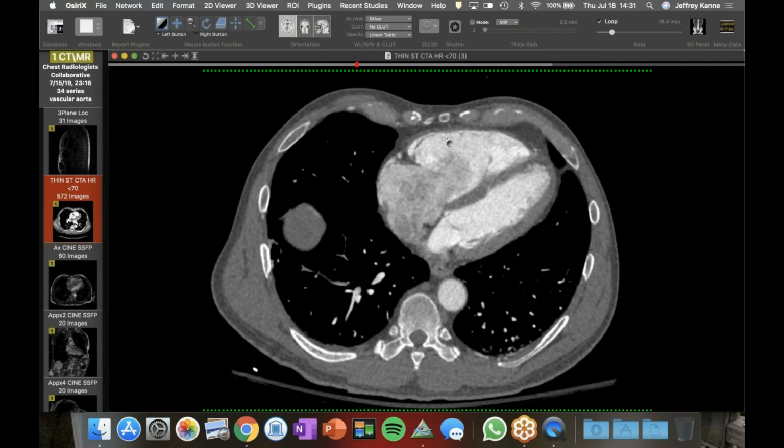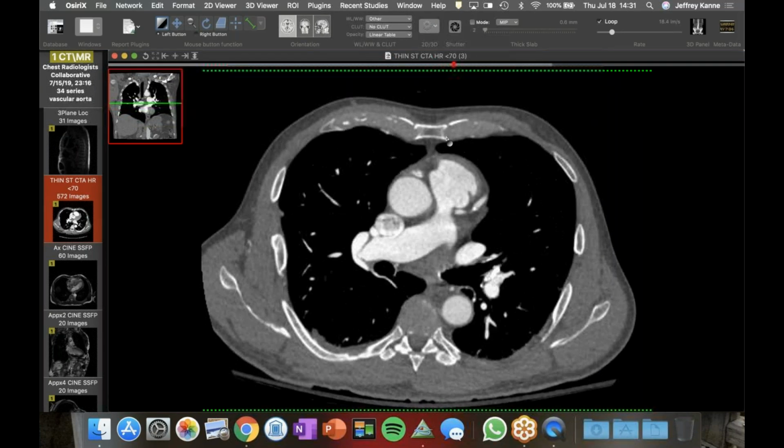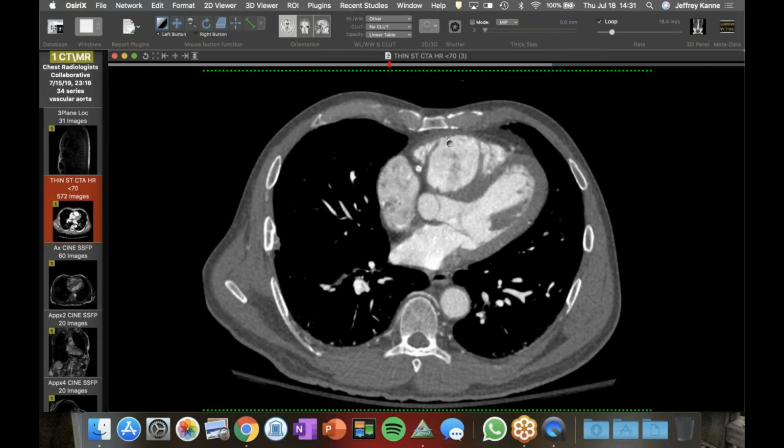And you got some nice smoke artifact in here too, just for you, Travis. Wow. Yeah, so and these can be really tough to manage. And warfarin is the standard, but he was on one of the newer agents. But even with anticoagulation therapy, this can still happen.